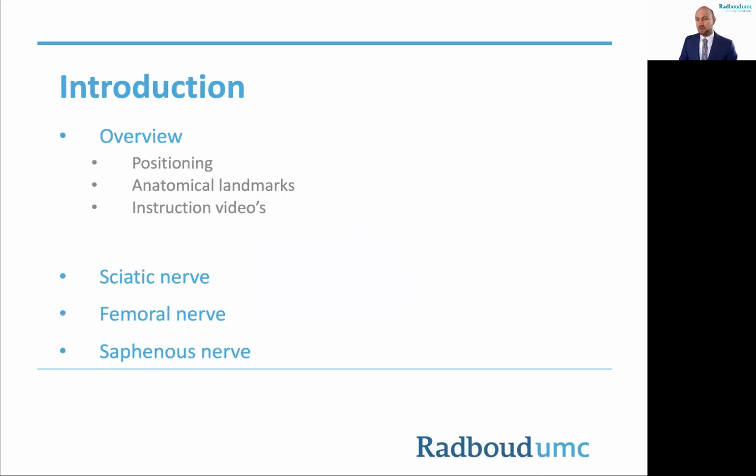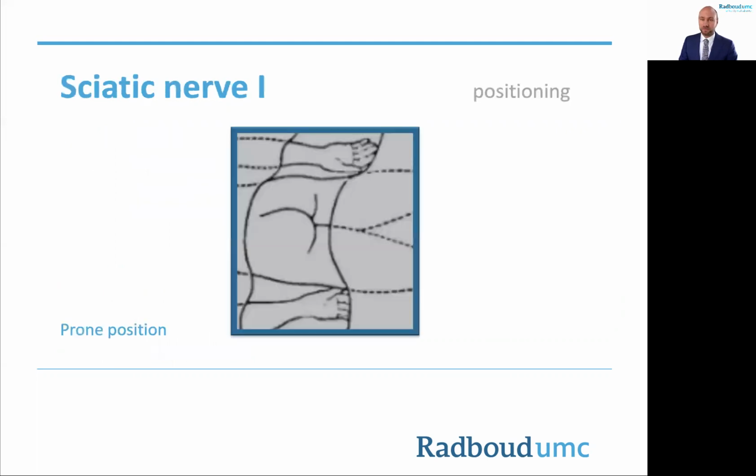For each nerve reviewed, I will discuss the positioning of the patient, important anatomical landmarks, and finish with an instruction video. We will discuss the sciatic, femoral and saphenous nerve. Let's start with the sciatic nerve.